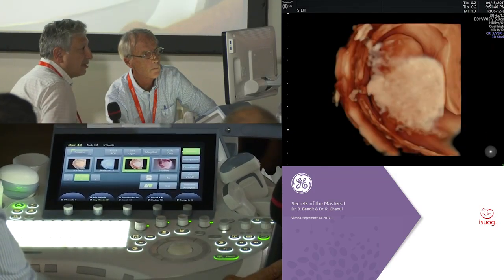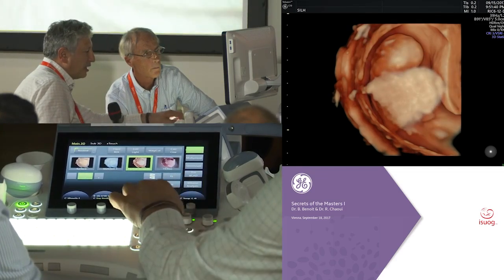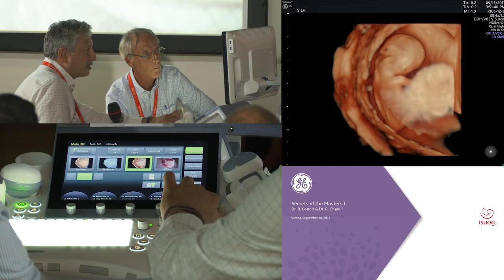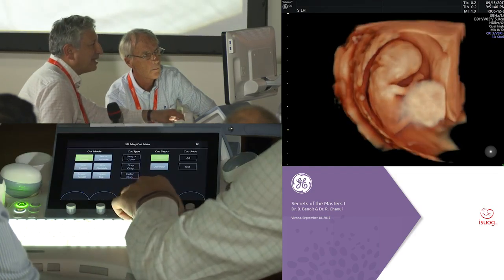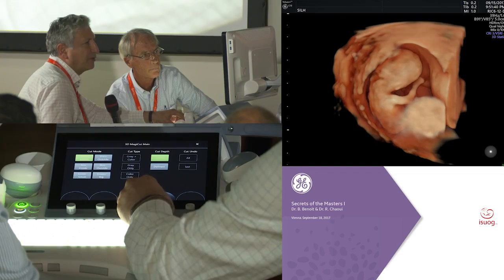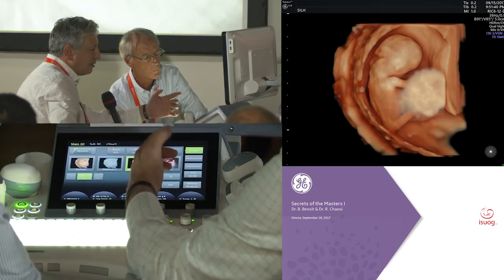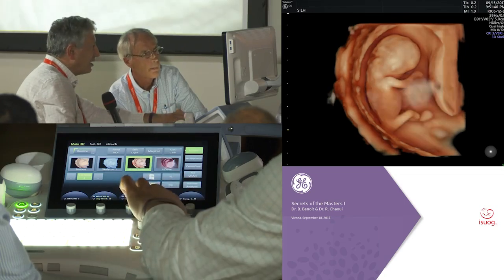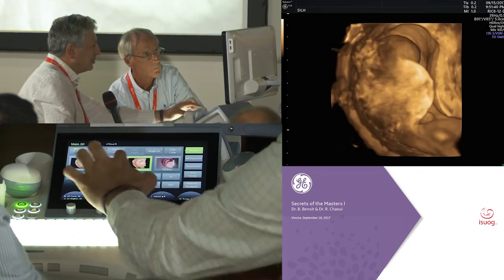There is one way to work on a volume. You go, and if you are like this, you start to make a magic cut. But sometimes it's difficult because you may cut part of the arm or of the body and so on. And so the way I learned from Bernard at one of these meetings, return back to the initial, oh my God. So is this way.